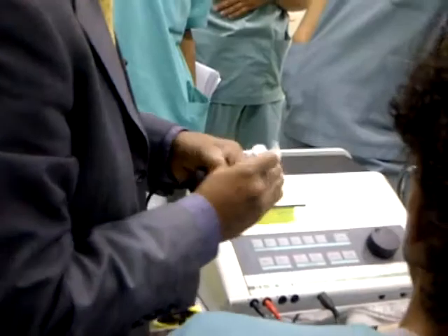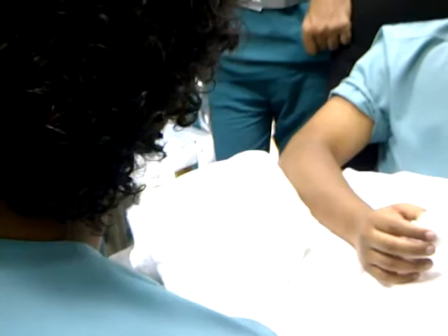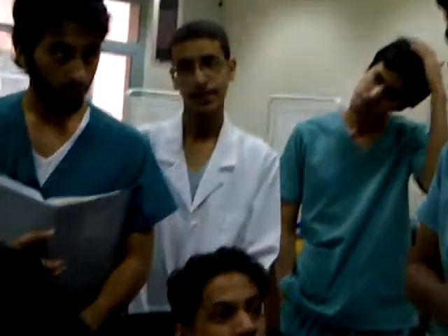So now the area you have treated also doesn't make any rash, skin disease or any problem in the skin. So that is the property of gel. Wait 1 minute.